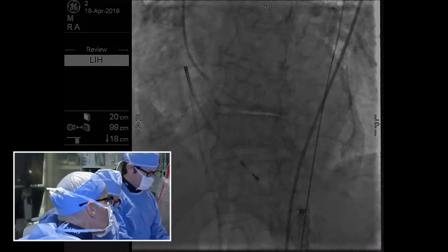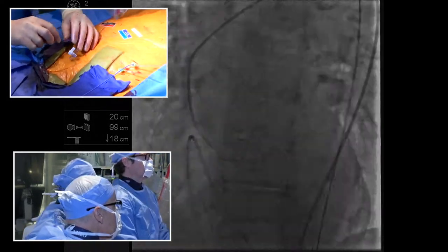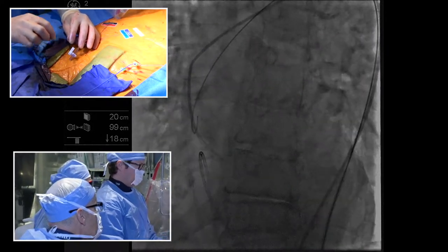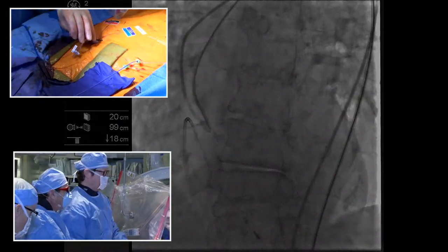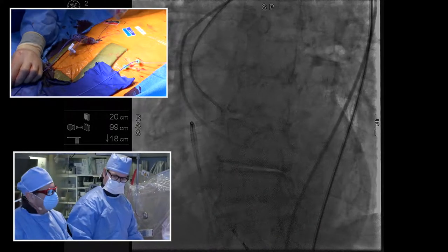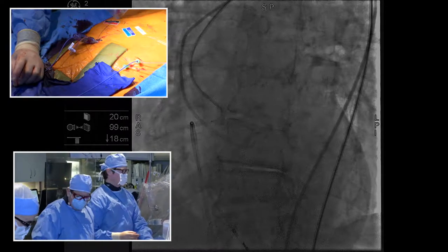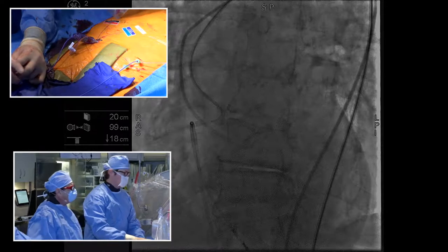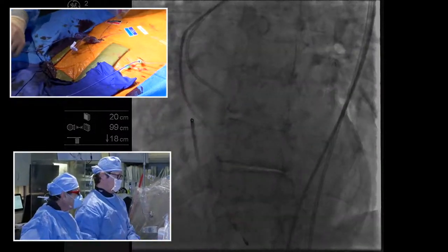Okay. All right, so the next step is to cross the valve. Now, this frustrates a lot of people when they're learning, and frustrates a lot of people after they've learned too. We probably could use some technology here to get us across the valve faster and more reliably. The blood is going across the valve in the other direction, right? We're going to cross retrograde, meaning we're going to cross backwards. I've got a straight wire here, and basically Ray's job is to fiddle with the catheter enough to aim for the small channel.